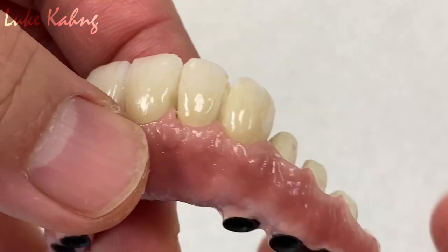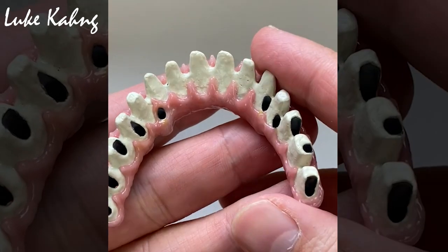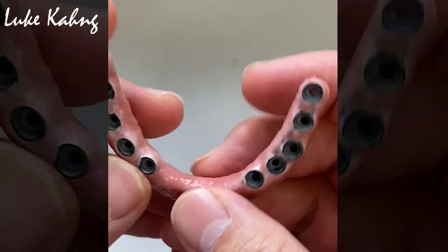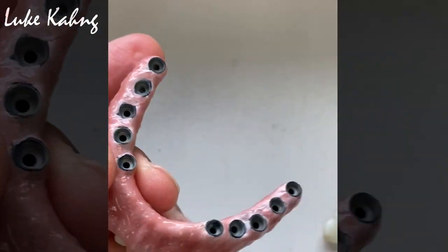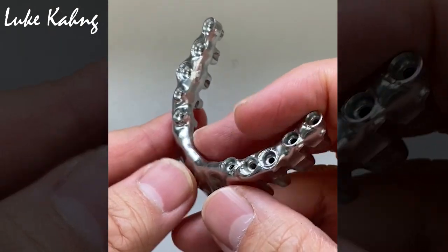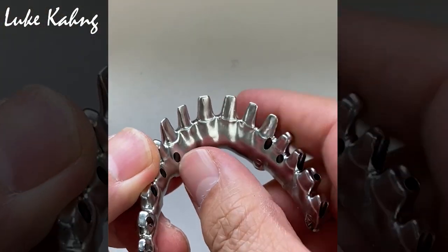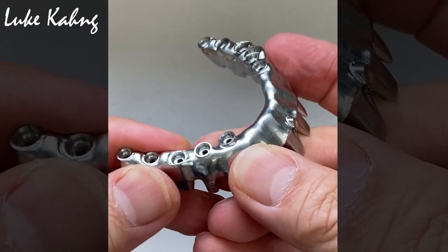About the tooth — okay, so this is the final with the CITON 7-star cases. Alright, so we made exceptional hygiene here. And basically this one is like the frame design. So that's number one — we got the full benefit for this patient, and it's exceptional hygiene.